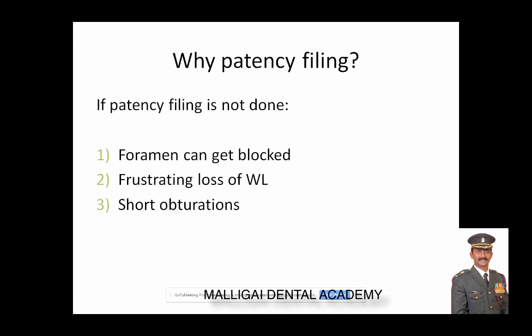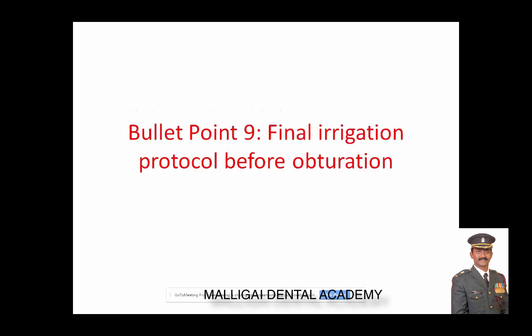The second last bullet point of today's webinar: have a final irrigation protocol before obturation of your root canal system. What does the final irrigation protocol help achieve?